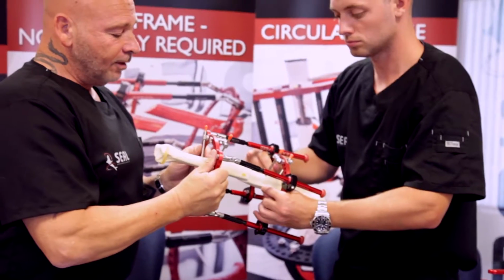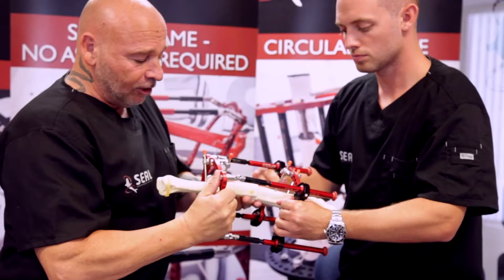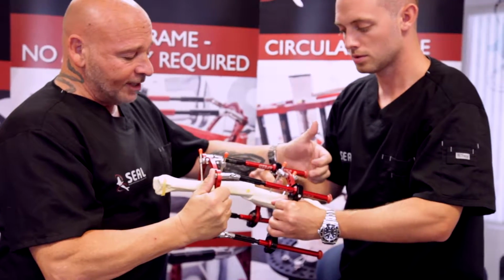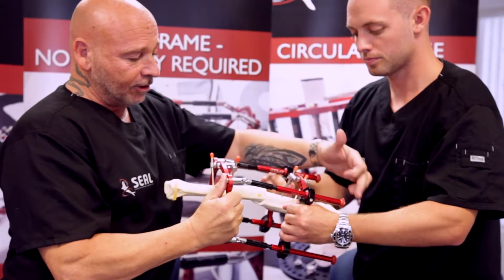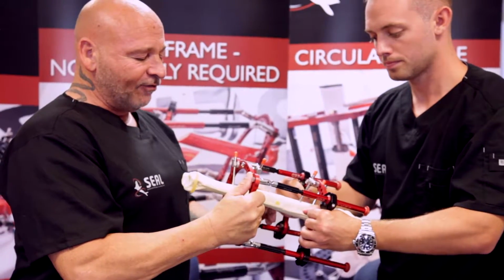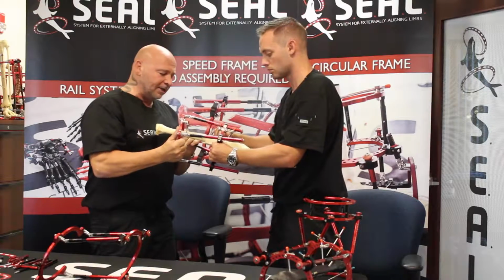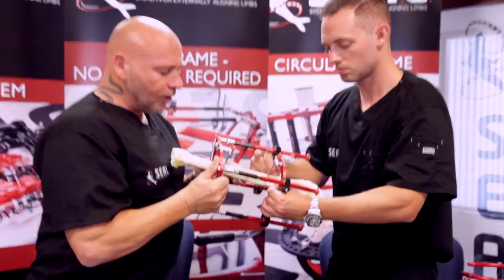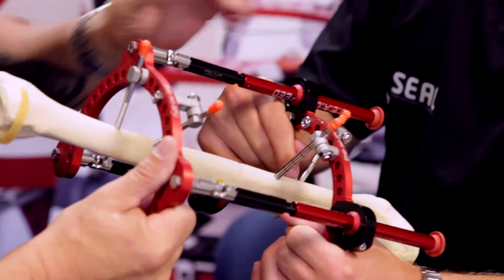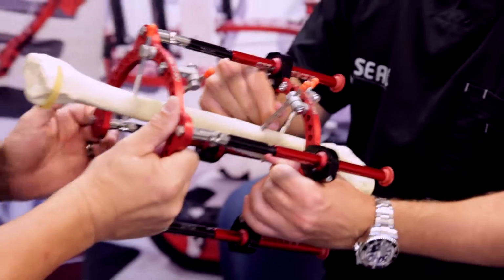Now, if after you tighten the 4 clamps your fracture is a little bit displaced, maybe you're up here, all you have to do at that point is compress and move these either counterclockwise or clockwise to bring everything back to where you want it. So you have the ability to fine-tune the fracture. After you reduce it, put it back where you want it, lock it in to pretty much where you think it's perfect, lock the 4 clamps, and then adjust it by fine-tuning. Maybe you need to pull this in a little bit. Maybe you need to distract the other side just to get it perfectly where you want it.